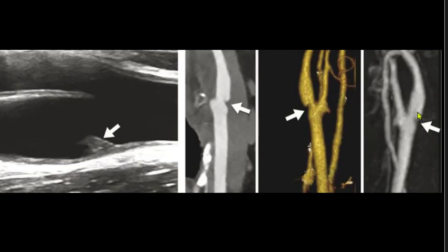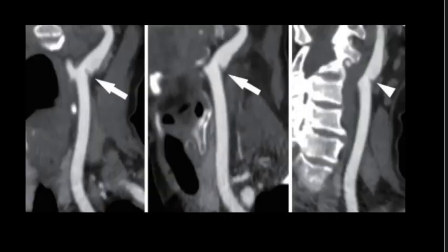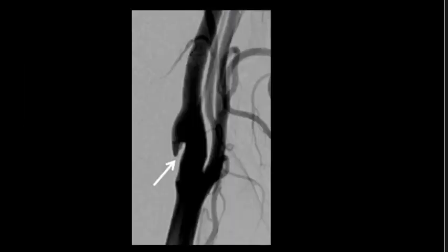Similar changes can also be seen on this MR angio of the carotids. This is another example of CT angio of the carotid. We can see in all 3 images there is a shelf-like web in the proximal most portion of the internal carotid artery. Here we have an example of a conventional carotid angiogram, where we can see a shelf-like projection in the proximal portion of the internal carotid artery.